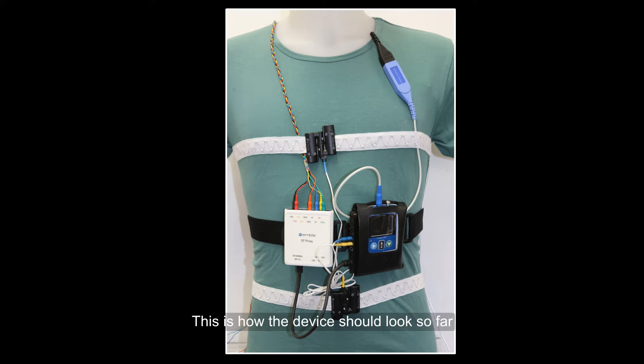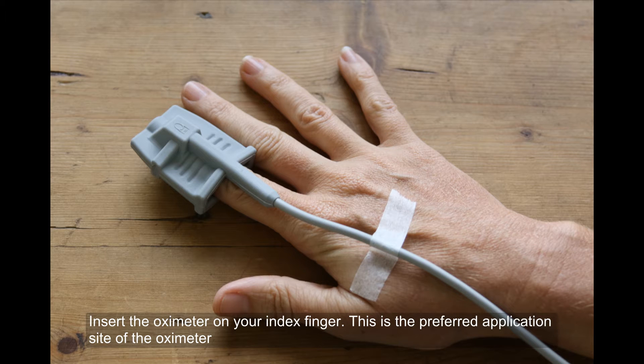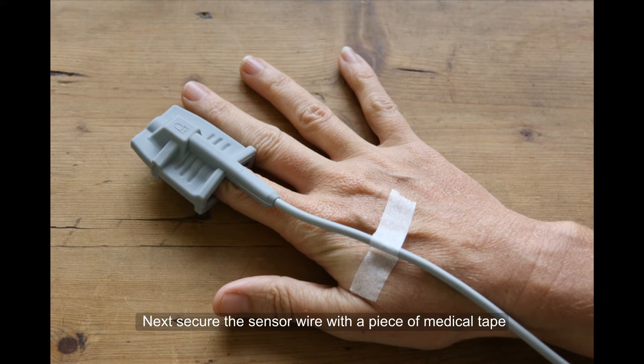This is how the device should look so far. To monitor your oxygen level accurately, you must remove any polish from your fingernail before securing the sensor. Insert the oximeter on your index finger — this is the preferred application site. Next, secure the sensor wire with a piece of medical tape.